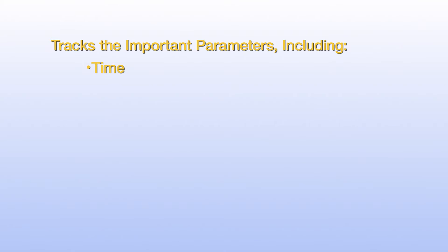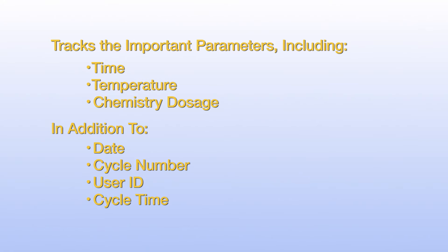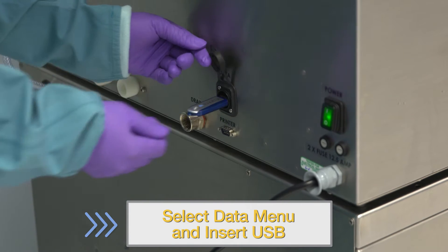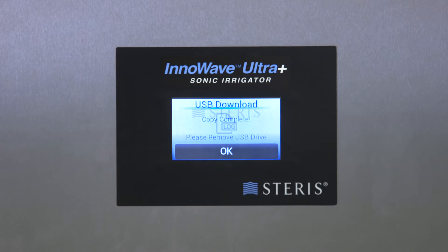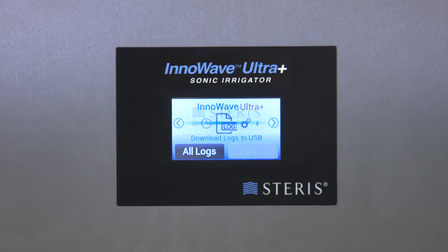Tracked parameters include time, temperature, chemistry dosage, date, cycle number, user ID, cycle time, and cycle errors. Go to the Data menu and insert a USB drive to initiate the download of cycle information. You can choose to either download all cycle logs or just the new cycles added since the last download. Cycle confirmation will be shown on screen once the download has successfully completed.